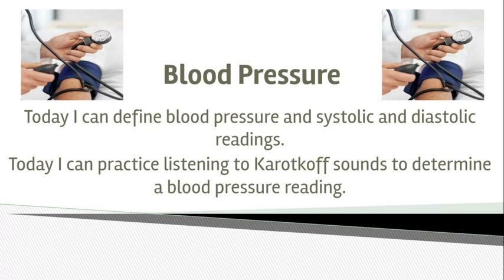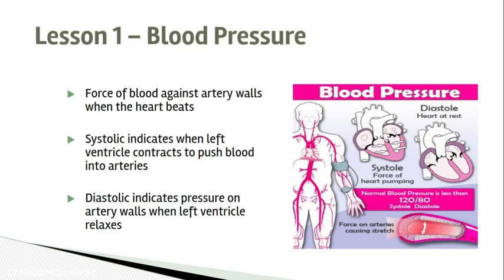Today, we're going to learn about the last vital sign, which is blood pressure. My goal for you is that you'll understand what a blood pressure is and the difference between systolic and diastolic readings. You'll also be able to practice listening to the Korotkoff sounds, which is the heartbeat you hear when taking a blood pressure to determine what somebody's blood pressure reading would be.